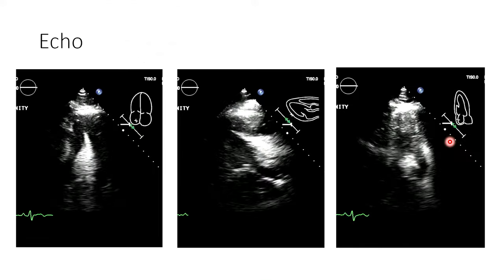Yeah. Now, before I see the cath, it's a transplant evaluation, so we know he's a high-risk patient. But what if he has a bunch of diffuse disease and some lesions? Can you really differentiate the epicardial versus microvascular contribution?